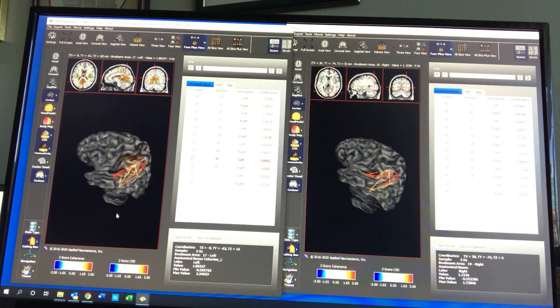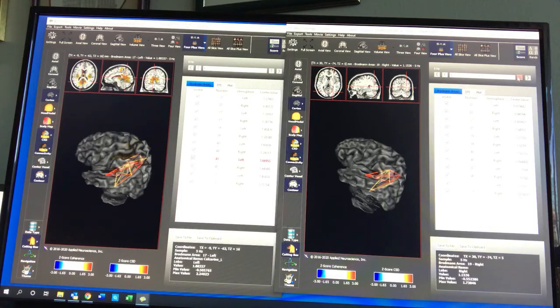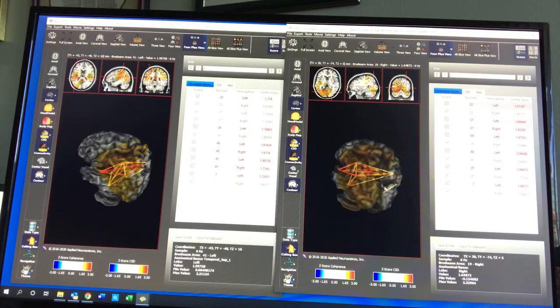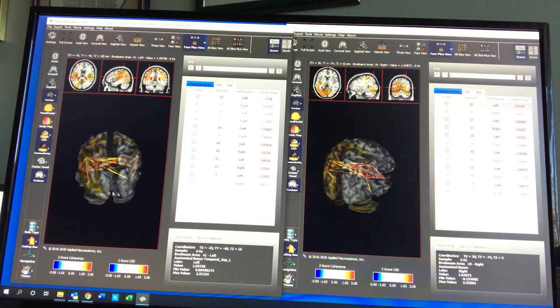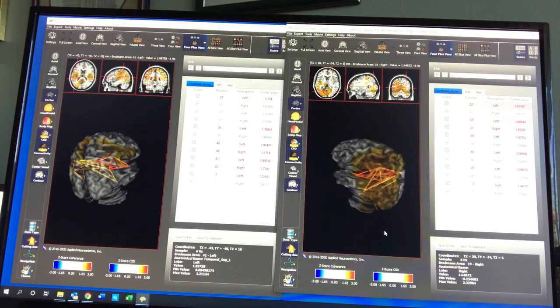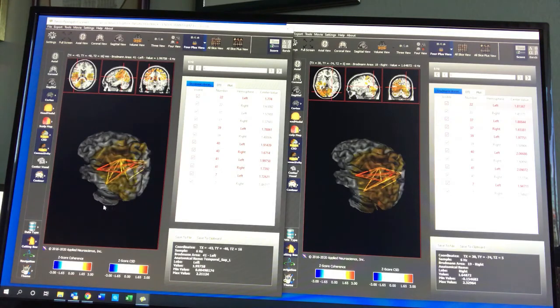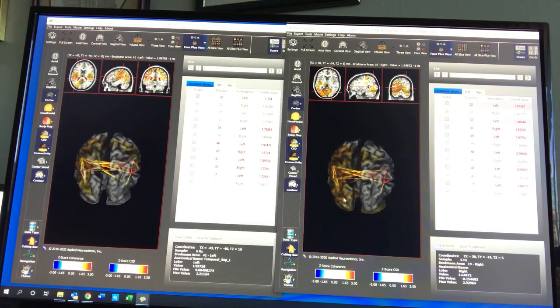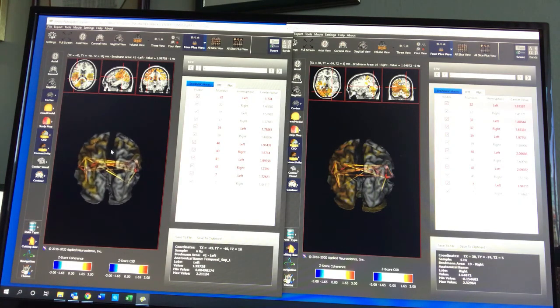You can't get done what you need to do in any 10 sessions with anything. So here we go at 6 hertz in both images. At 6 hertz, we see a lot of slow wave frequency in what we call the theta frequency, and a bit of foggy brain, inability to understand. And we see a lot of that as well in the second image. More clearing in the right brain than in the left on this image after 10 sessions, but when we look at the connectivity, we got some change. If we look right into the middle along the vermis in the midline area between the hemispheres, there are some connectivity shifts that are positive in both arenas.